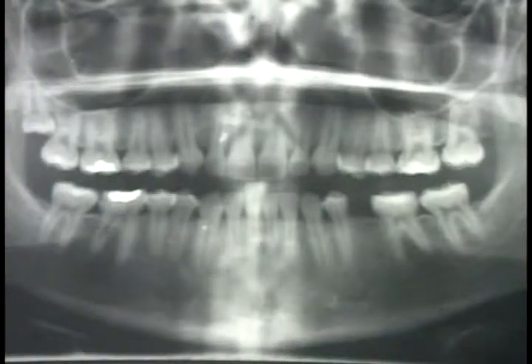The safe distance from the apical aspect of the implant and the superior aspect of the mandibular canal will lessen as the surgeon becomes more skilled and more confident. The most important safeguard against violating the canal space is the use of infiltration anesthetic rather than block anesthetic. With infiltration anesthetic, the patient will be able to communicate to the surgeon if any of the instrumentation is too close to the mandibular canal. In this example, with 14 millimeters of bone superior to the canal, there is more than an adequate safety margin for the anticipated 9 millimeter length Endopore implant.